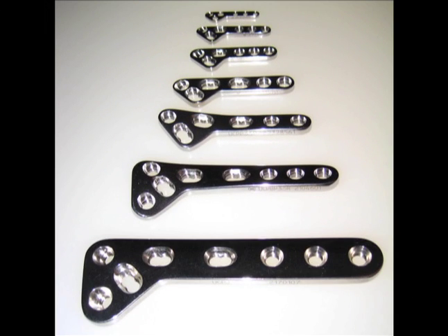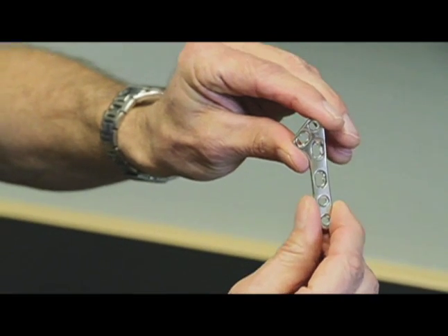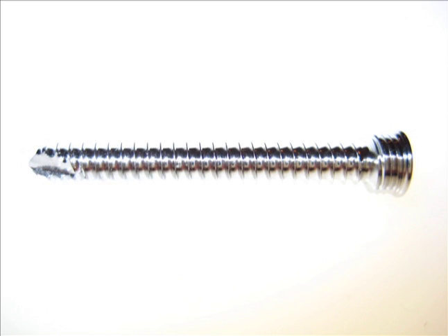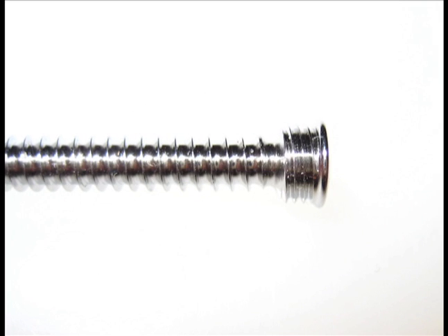Bone plates come in a variety of sizes and shapes, also about 10 different sizes and shapes. They're made of either surgical stainless steel, which is most common, which is what this plate is, or of titanium. And then there are some other really unique factors coming into play with today's bone plating technology. One is locking screws. This has been a big advancement in veterinary orthopedics in general and human orthopedics, but very specifically with the tibial plateau leveling.